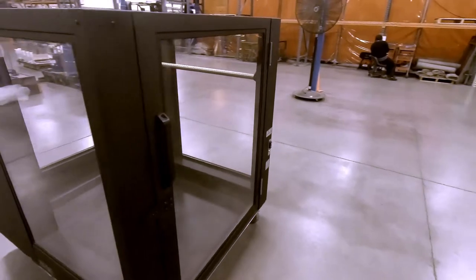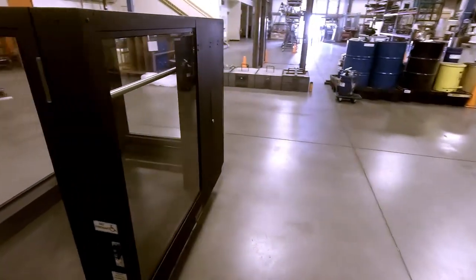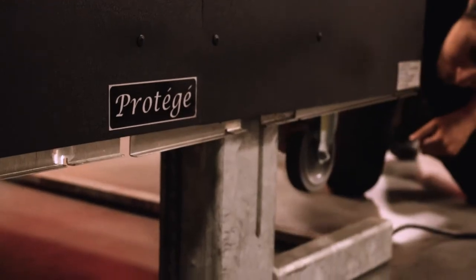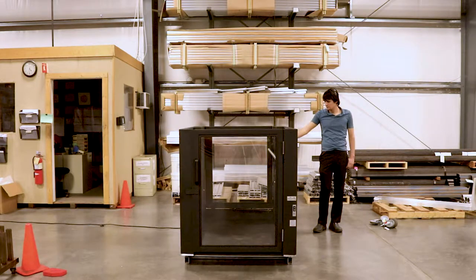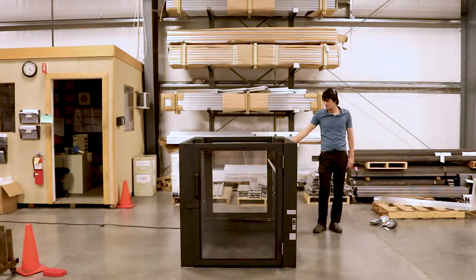Why won't the lift do anything when I push the up or down buttons? This wheelchair lift is equipped with a number of safety features that will prevent the lift running up or down. If the lift is a portable model, make sure that the wheels have been removed and the lift base is sitting on the ground, as the lift will not operate normally with the casters on. See the setup procedure for instructions on how to remove the casters.